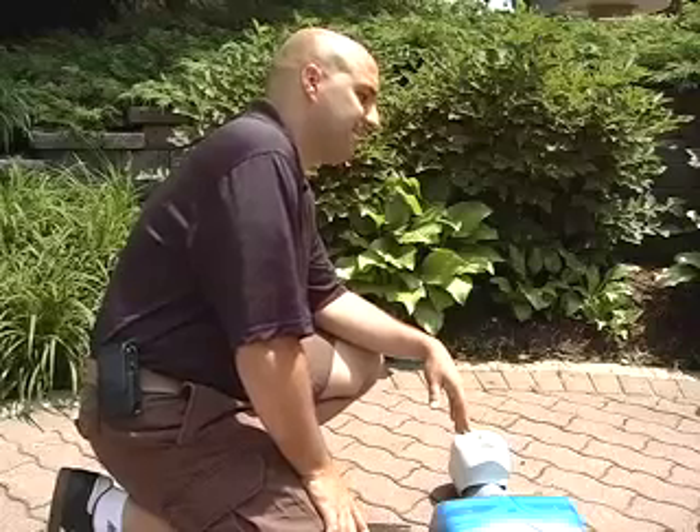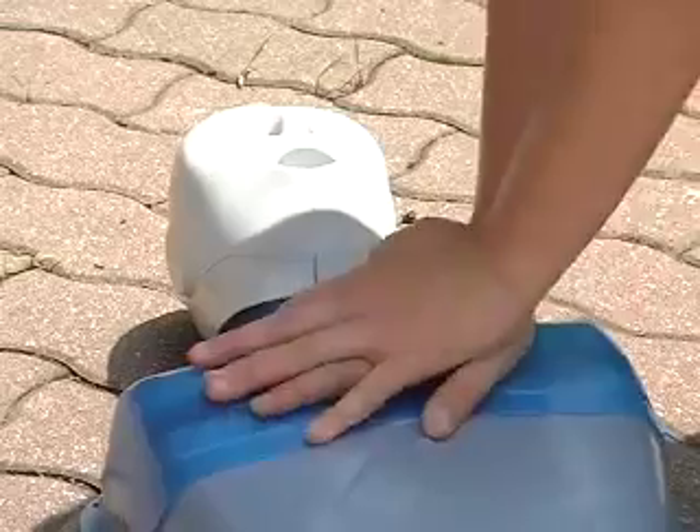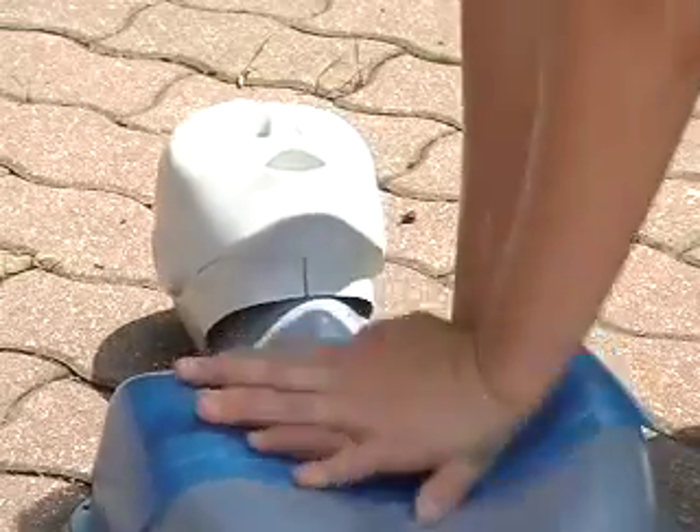So far, Clash has received positive feedback about his invention. Other CPR instructors say at first glance the idea works, but in the end it will be up to the user. Anything we can do to get them to do it the right way is the most important thing, and it seems like his method is one way that's going to accomplish that.